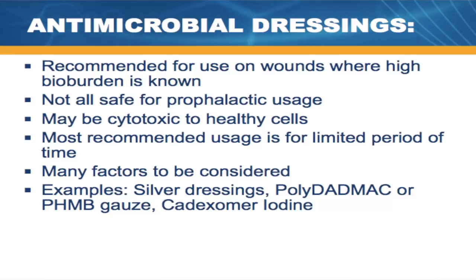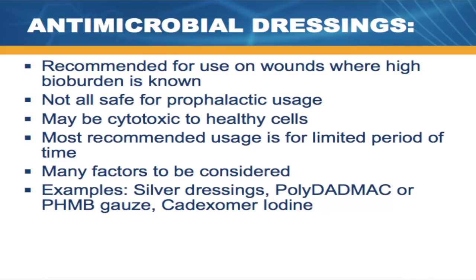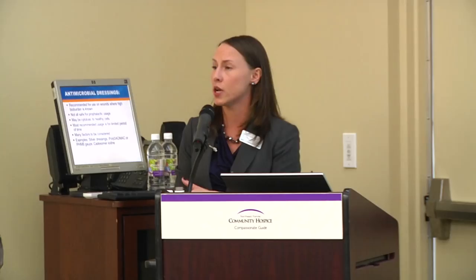A whole other category of dressings that really encompasses a little bit of everything I've talked about are your antimicrobial dressings. An antimicrobial agent can be put into just about anything that you see. Our military uses it in their clothing. In a lot of the public restrooms you go into in airports, you'll see the walls or the stalls are actually silver impregnated. You can put an antimicrobial agent in anything, including all of those other types of dressings that we've talked about. Most commonly, the antimicrobials you'll be seeing are your silver dressings, very often your Leptospermum honey dressings, your iodine dressings, and then also your polydadmac and AMD dressings, or your PHMB dressings.